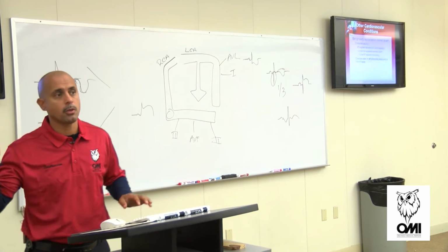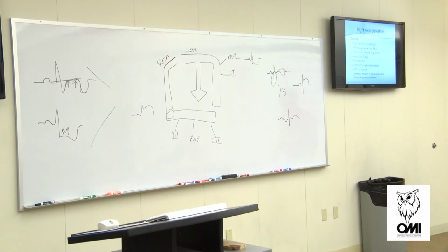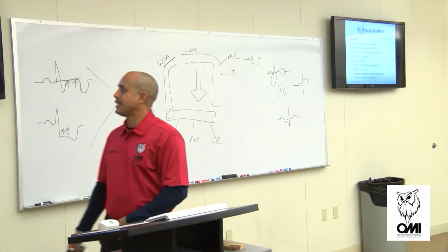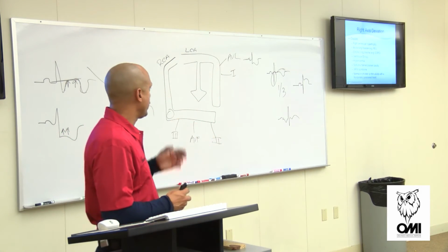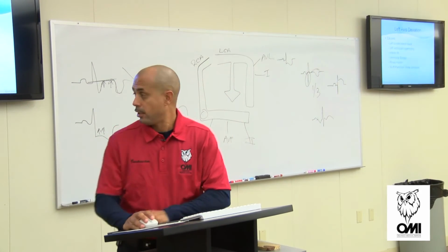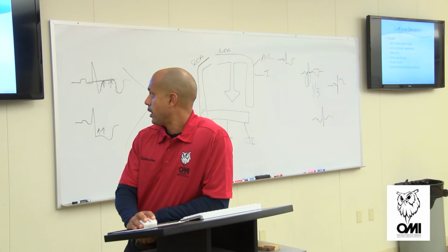I'm going to bring up something more in depth than the one I did at the presentation. So right axis deviation, if you want to know what causes right axis deviation, these are some of the things that cause it. Okay? It's not treatable though? Yeah, treatable.